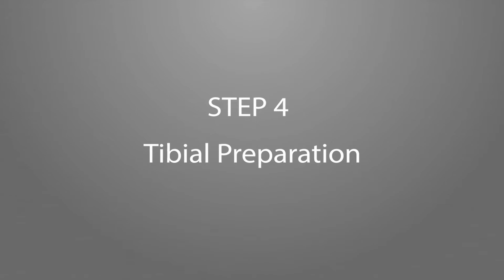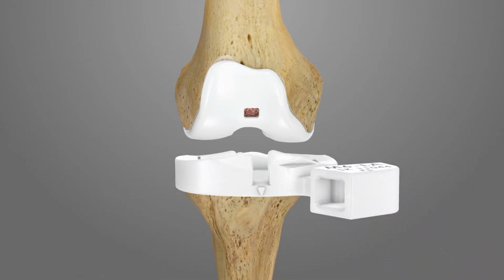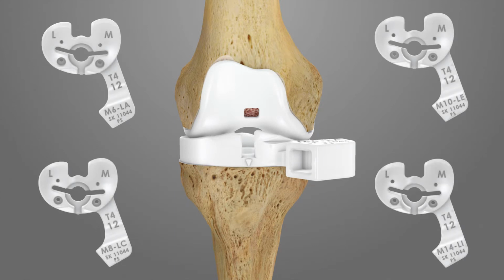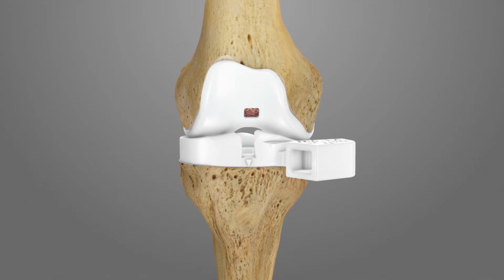Step 4. Tibial preparation. Confirm peripheral tibial osteophytes have been removed and place the tibial preparation iJig T4 onto the cut proximal tibial surface. Multiple thicknesses of the T4 iJig are provided that are equivalent to the thickness of the tibial tray plus the thickness of the tibial poly inserts. The T4 iJig has the same profile as the tibial tray and should be positioned for optimal plateau coverage while keeping to the posterolateral corner of the proximal tibia.